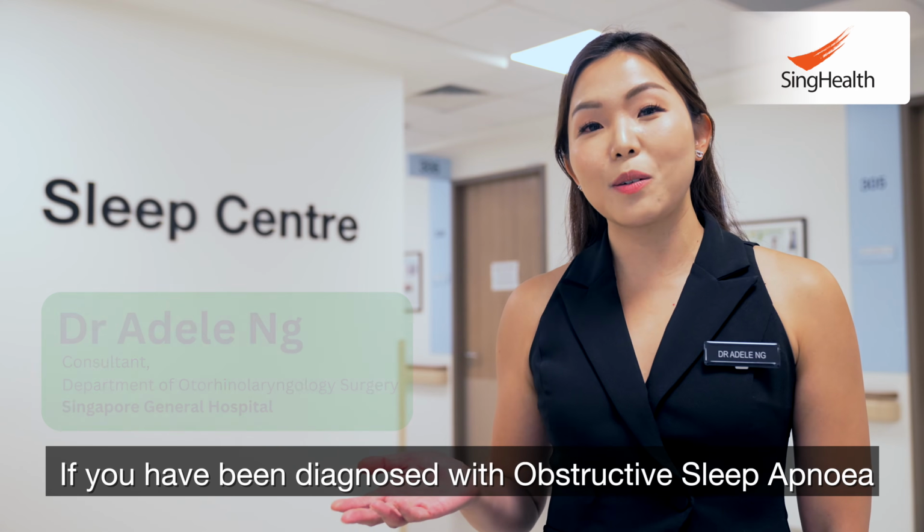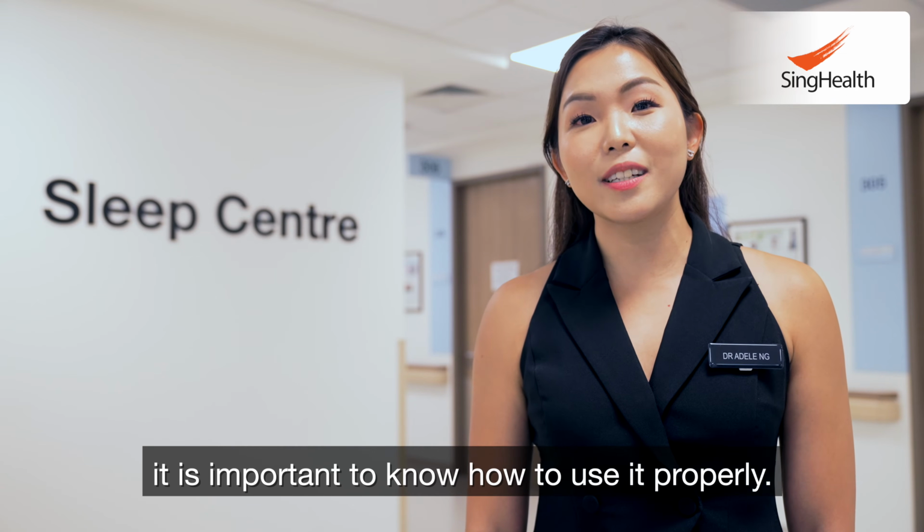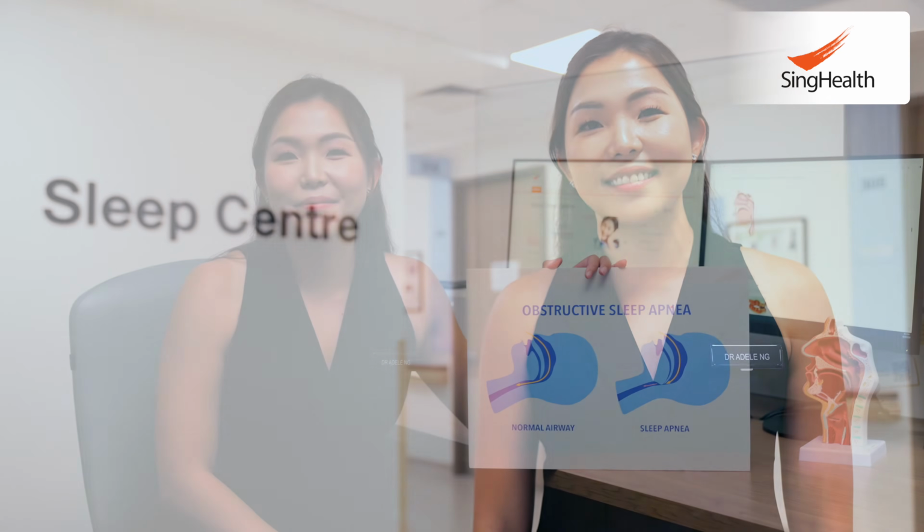If you have been diagnosed with obstructive sleep apnea and have been prescribed a CPAP machine, it is important to know how to use it properly.